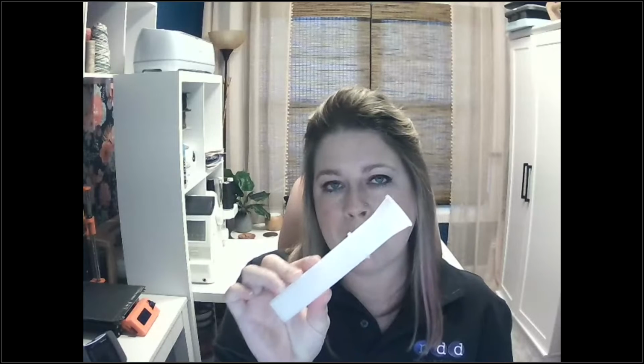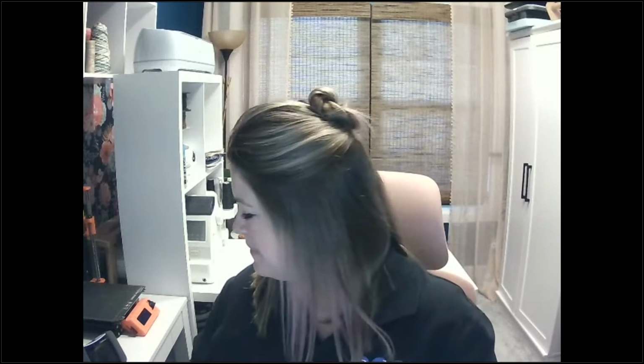All right. You'll need your single patient use flow tube mouthpiece. If your facility requires inline filter use for spirometry, you would need the EasyOne Filter FT for flow tube. So you'll see that the back is kind of shaped like a rectangle, just like the EasyOne flow tube.